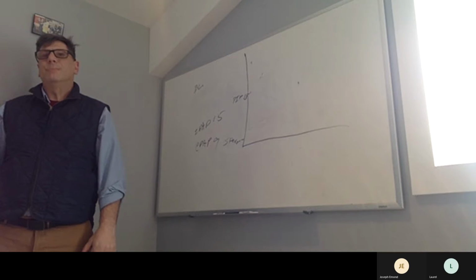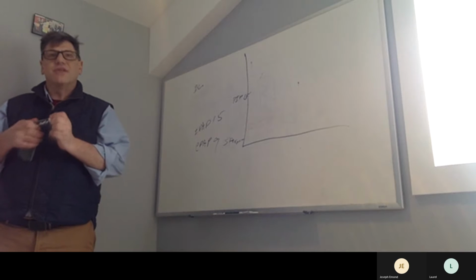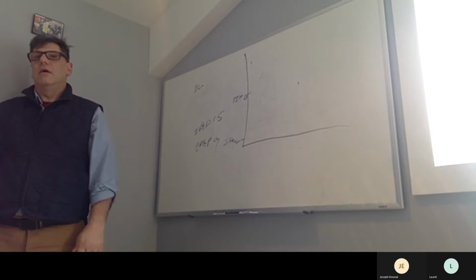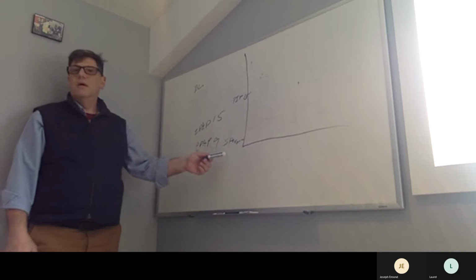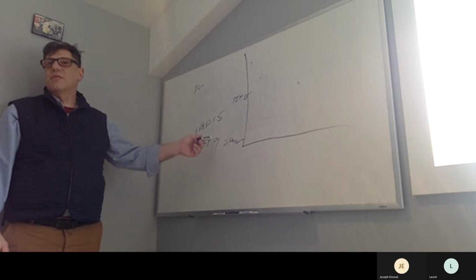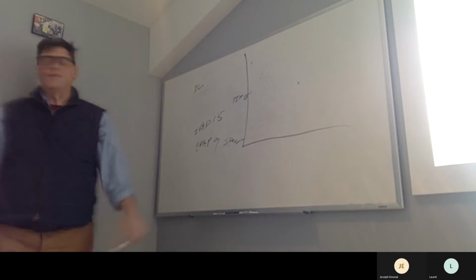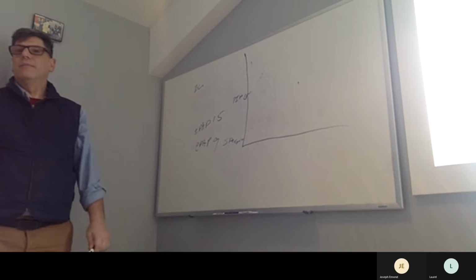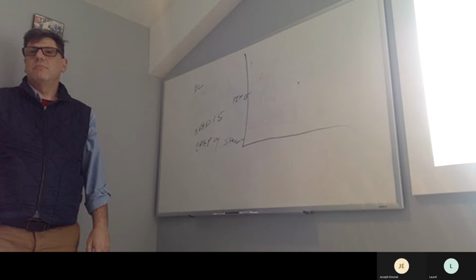Now, would we adjust the EPAP to get there? What gas do we exhale? CO2. Thank you. Exhalation positive airway pressure. So if they don't have enough exhale, I can increase this a little bit more. What gas do we inhale? Oxygen. So how am I going to increase the exhalation by increasing minute volume?